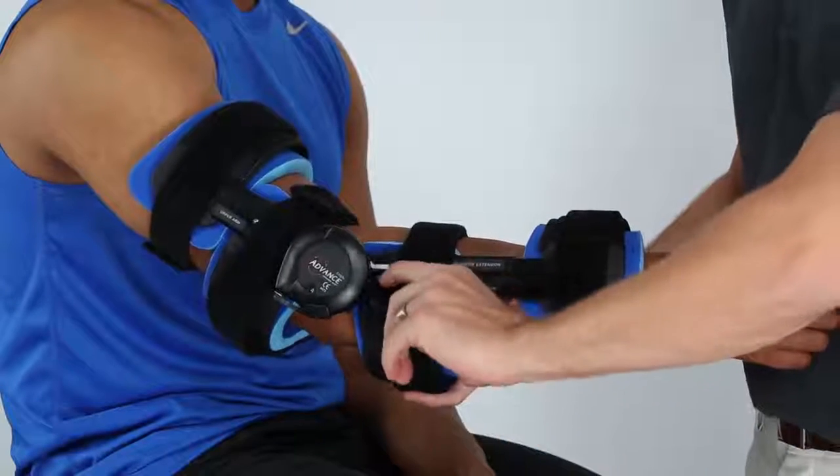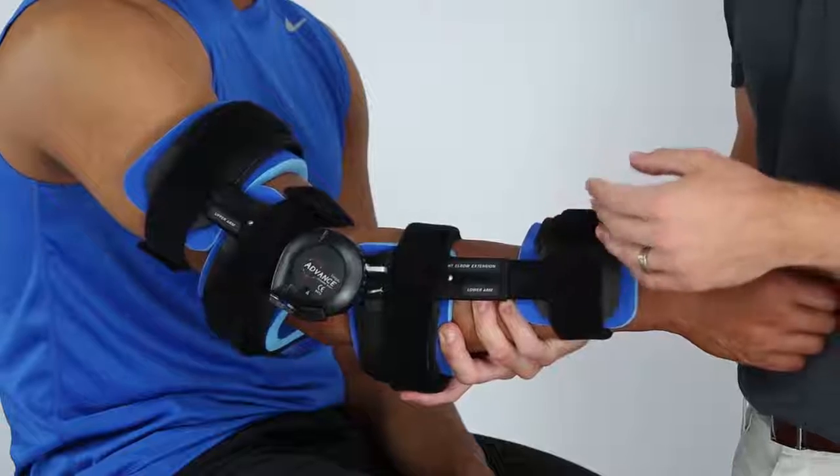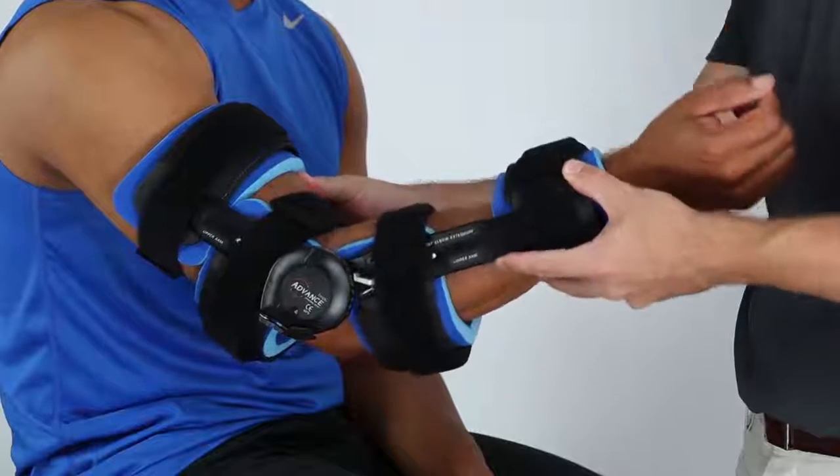First, disengage the lock lever safety by swinging it away from the lock lever. Then apply a slight force on the strut to disengage the lock lever.